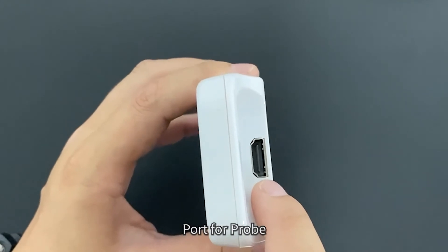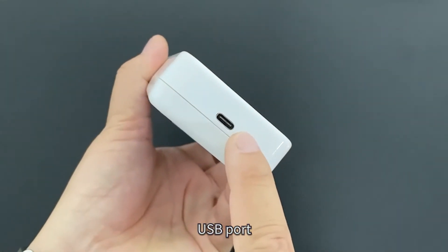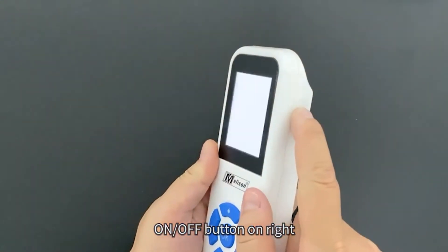The device features a port for the probe, a USB port, and an on/off button on the right side.